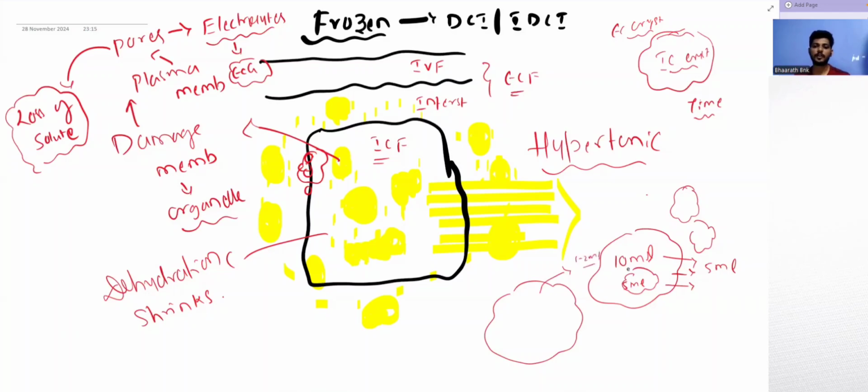But even before it can get out, 8 to 9 ml of the fluid in the cell has converted into ice, right? So if there is rapid cooling happening, more of the fluid intracellularly gets converted into ice even before it has a chance to get out of the cell, and that causes more damage. So those cryoprobes in which rapid cooling happens lead to a greater amount of intracellular ice formation, and greater will be the cell damage. Right. So this is what happens in a freezing section.